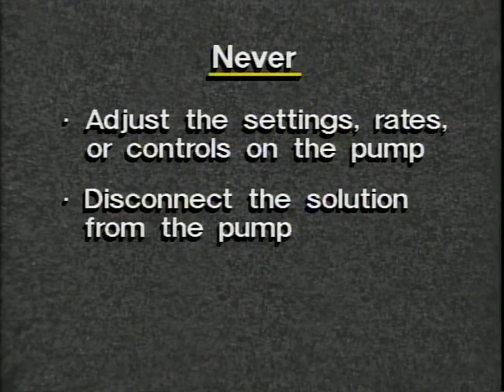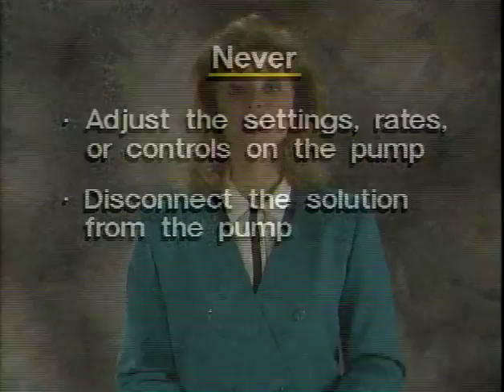Never disconnect the solution from the pump. Have emergency numbers of the home care RN and caregiver available. Your nursing instructor or RN supervisor will familiarize you with your particular agency policy and procedure.